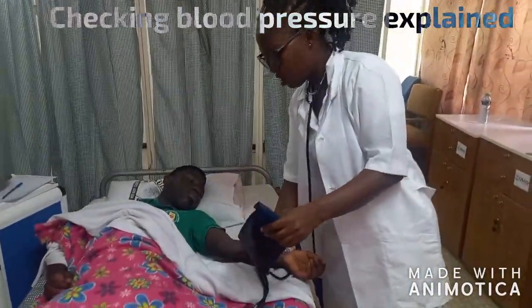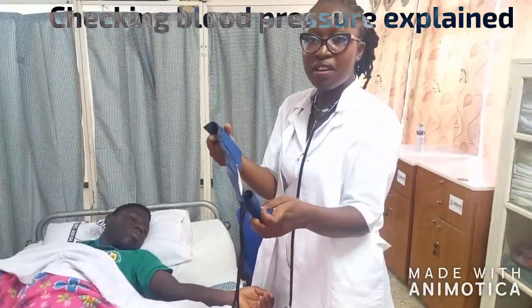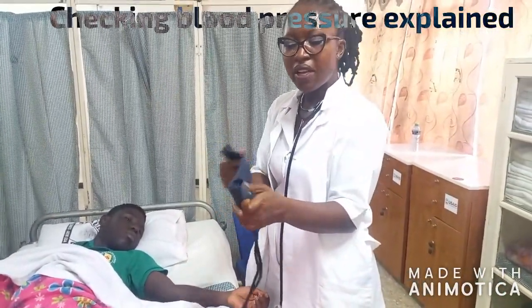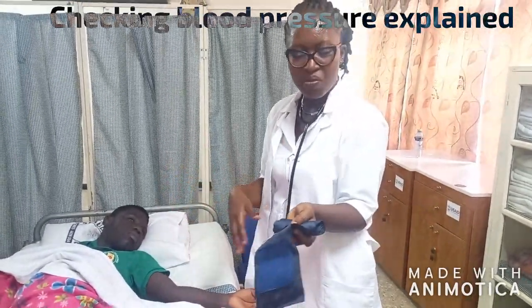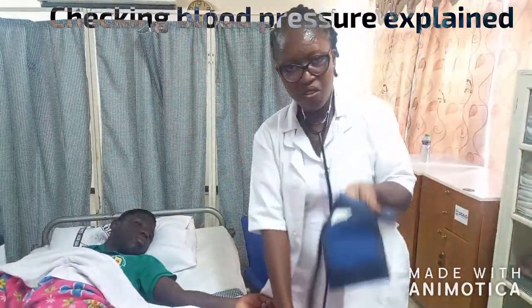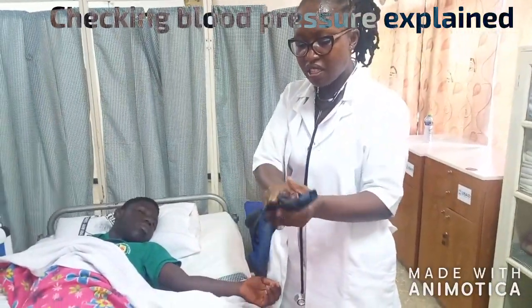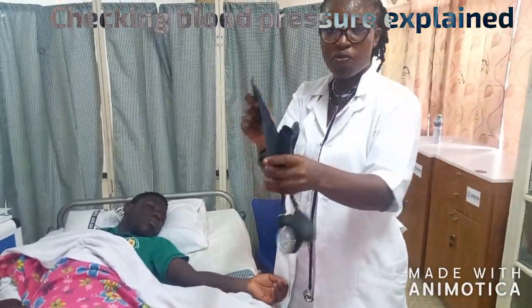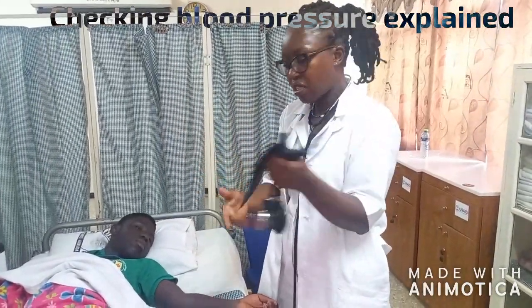Make sure — especially those cuffs that are very long — before you apply it on the patient, it should be rolled so that it will not be moving about while you are doing the procedure. And if the patient were sitting, you see that this one will be hanging on the floor. So you put it in your other hand like this, and you have full control of what you are doing, so that things will not be dangling up and down whilst you are doing your task.